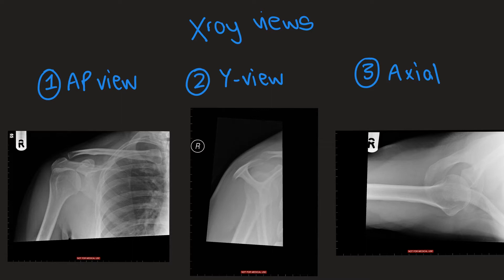On an AP view, what you're looking for in regard to the glenohumeral joint is correct alignment of the glenoid with the humeral head. The Y view is a lateral view in which you see the Y shape of the scapula. Anteriorly you see the coracoid, posteriorly you have the acromion and here you have the scapular body. Normally you should see the humeral head lying directly on top of this Y shape. On the axial view you should see the normal congruency of the glenoid and the humeral head.